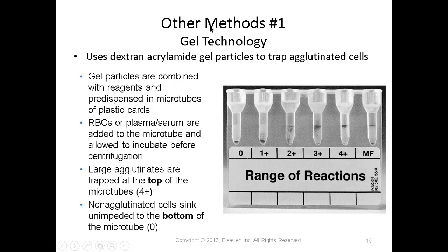Okay, so there are automated methods that have been developed to test larger volumes of patients, and one of these newer technologies is called the gel technology. We actually have this in our student lab at CCP. So when we get together for 1 or 2 labs just to do a little bit of testing, so you guys get some hands-on, hopefully in the fall, you'll get a chance to do some of this gel testing.